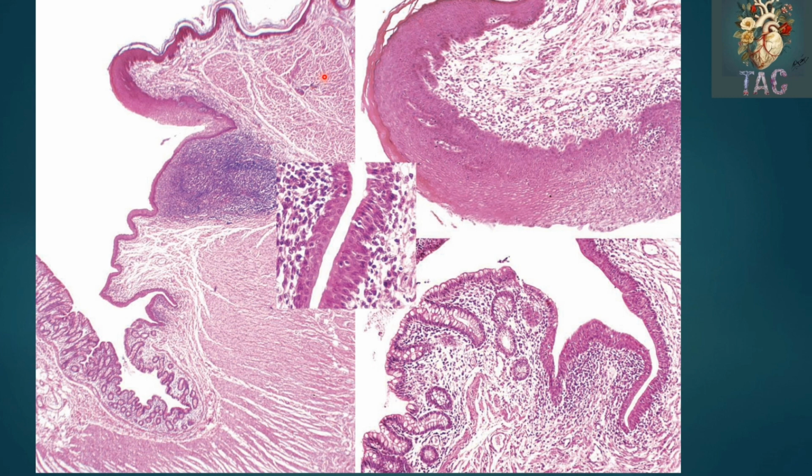So this is the whole story of the rectum, the anorectal junction, and the anal canal. Change of epithelium, change of the characteristics of the mucosa, change of the internal anal sphincter, and the epithelium now becoming stratified squamous. Here it is stratified columnar, initially it is stratified cuboidal, here it is simple columnar, and here it becomes the stratified squamous keratinized, which at the outer area will become the true skin.